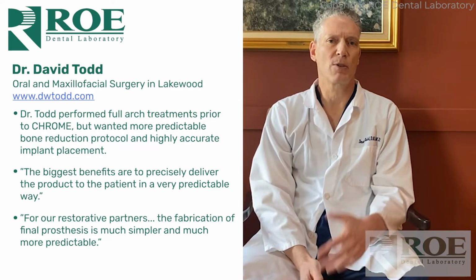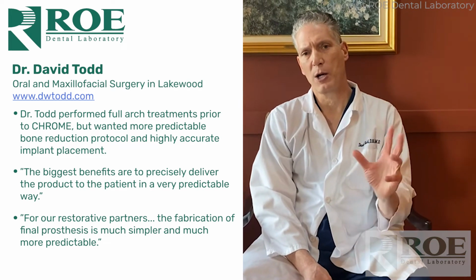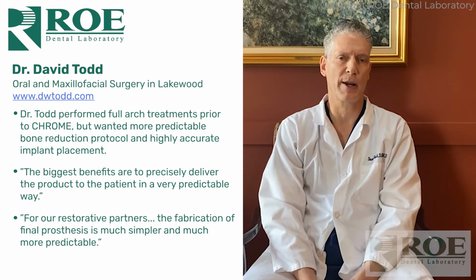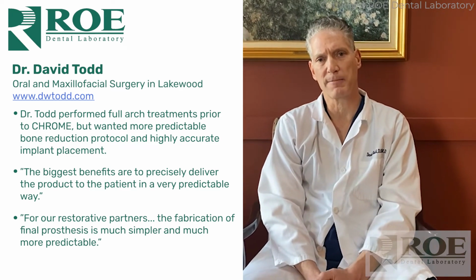Typically, once the rapid appliance and the temporary have been picked up, we deliver those to our on-site laboratory technicians. And while we're closing the case, they're finalizing the temporary for us, so we can deliver that shortly after we close the case. Got it.